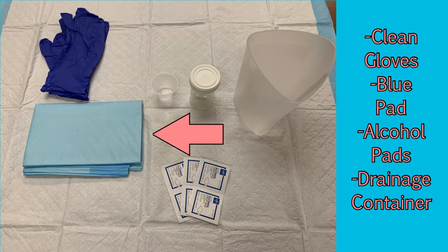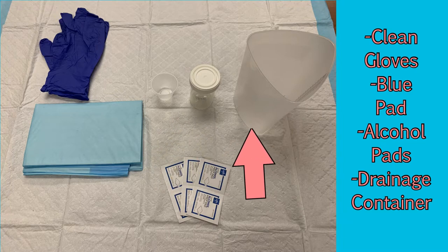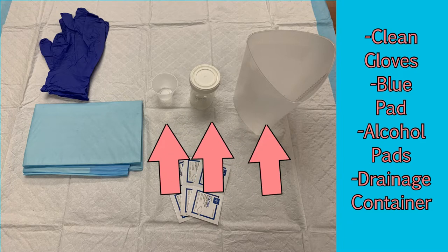You will need clean gloves, a blue pad, alcohol prep pads, and a receptacle for the drainage. There are multiple options for this. These three are useful because they also provide a fast method of measuring the output.